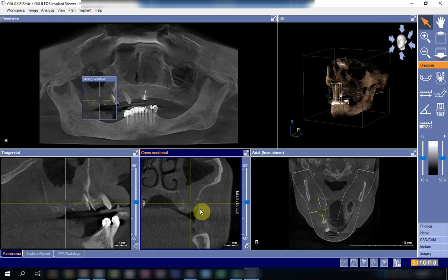The advantage of CBCT over 2D imaging — periapical or OPG — is that you can view the discontinuity from multiple perspectives: lateral, coronal, anterior, and superior views. Furthermore, because there is no superposition of structures in CBCT, you can clearly see any tissue growth or mucous membrane enlargement inside the sinus, which cannot be clearly appreciated in 2D images due to superposition of overlying structures.